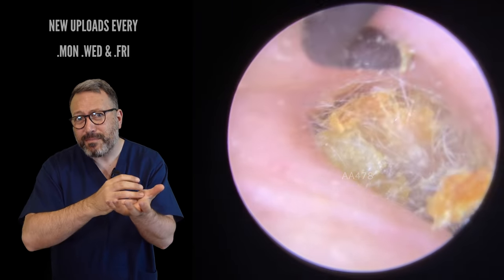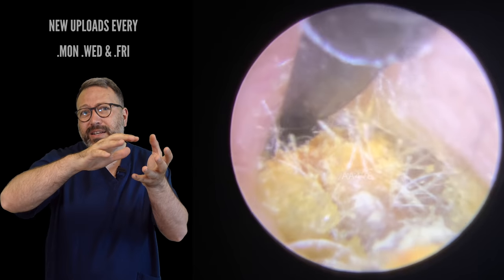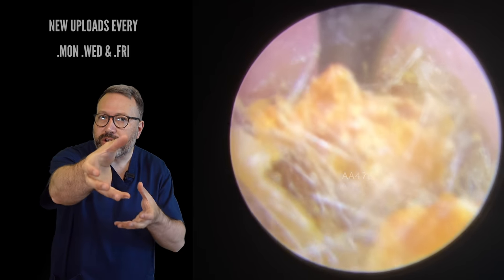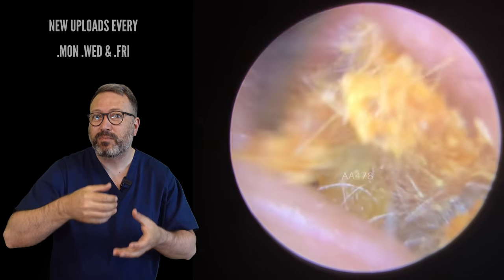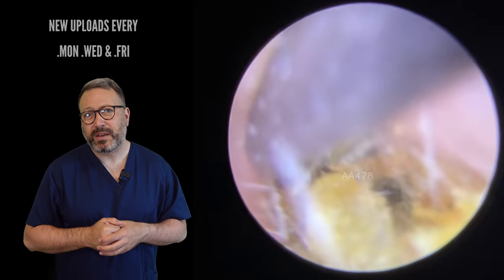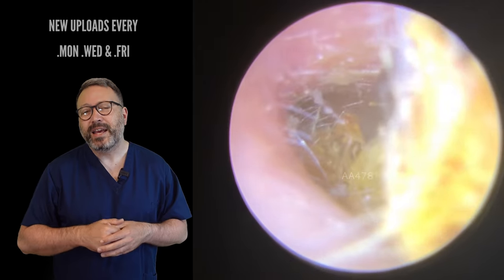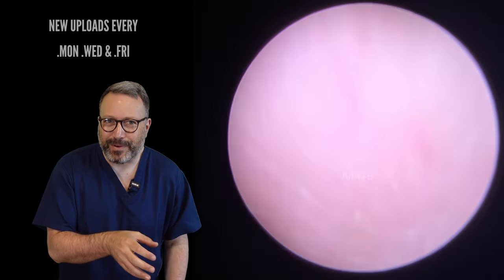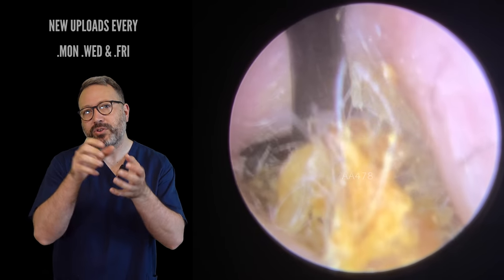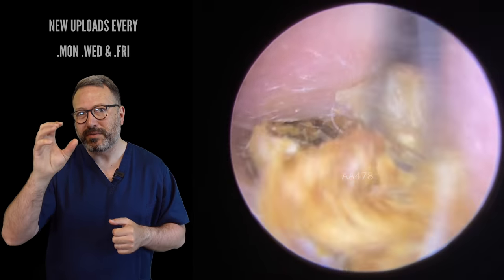Even the St. Bart's hook is really, really struggling to get through this. As we get behind, we're trying to get to a really hard piece of wax to draw the whole piece out. You can see the St. Bart's hook is just pulling through, breaking it down a little bit. Tough as all boots, this is. We're carrying on with the St. Bart's just over the top of this next section. I'm struggling to get this in — the St. Bart's hook is a lovely tool, but it has its limitations in that you need quite a wide gap to get it through. So we've gone back to the Jobson horn — we were just missing that little gap.